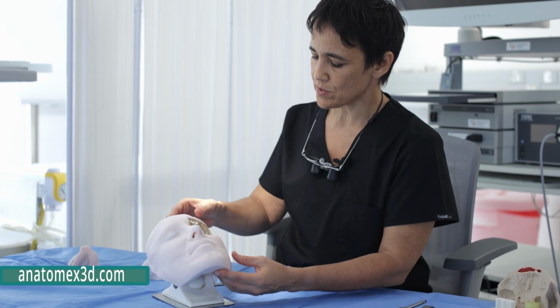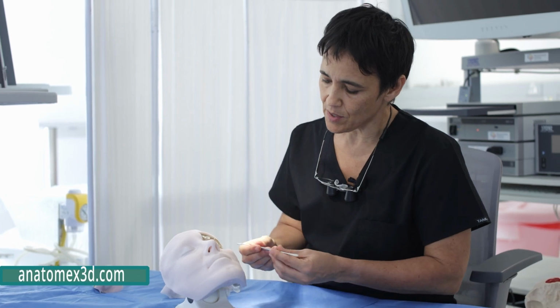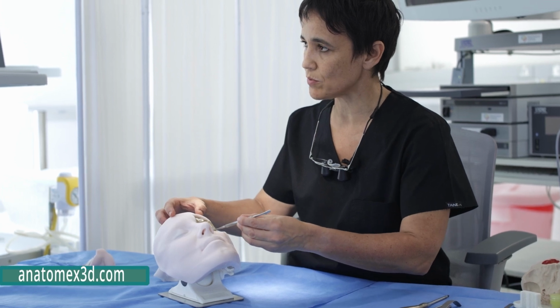But since Chris Moe developed the techniques of transorbital surgery back in 2010, we don't need to use the nose anymore to get to certain parts of the brain. We can now use the orbit, or the eye.